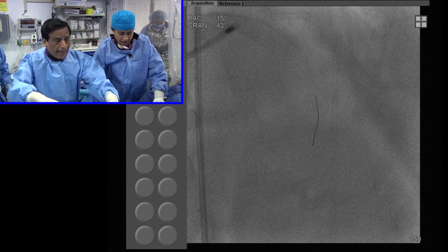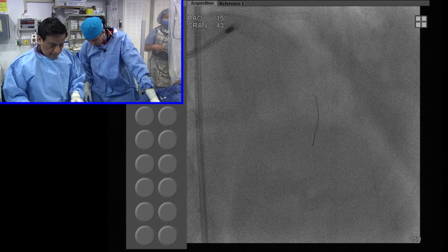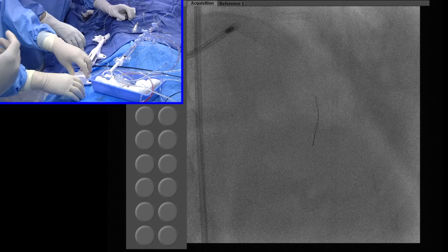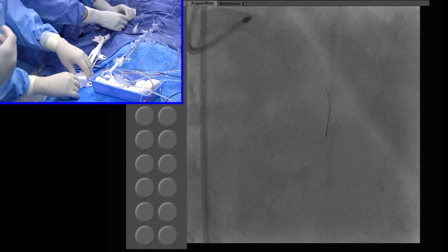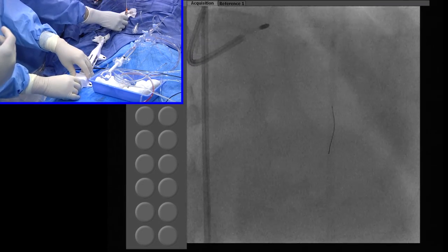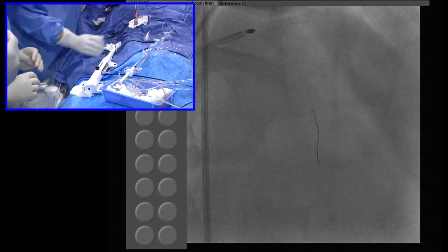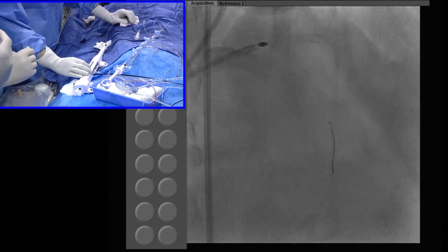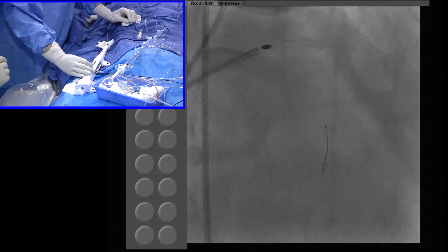Now Dr. Keeney is ready here for the rota of the LAD with the 1.5, so that we can come back here, and the wire we are going to advance a little bit more. Go. Wire is not going further, but that is okay, right? Good. So, it is a 1.5. We have done the regular techniques of removing the tension from the burr.